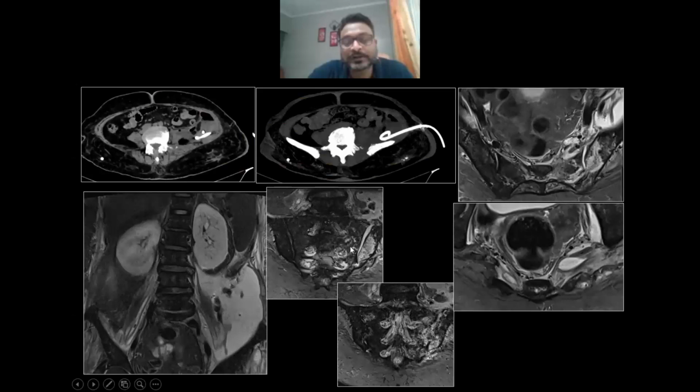This was actually sacroiliitis, and that information was really not evident on the CT, even after a second look evaluation on bone windows. And so you can see that there's a lot of marrow involvement along the SI joint effusion, and a whole lot of abscesses, not just the iliopsoas one, but smaller abscesses along the piriformis muscles, and the iliopsoas abscess was even tracking down into the thigh region.